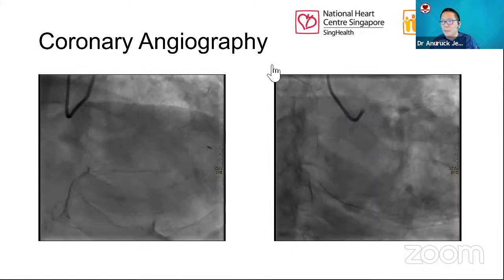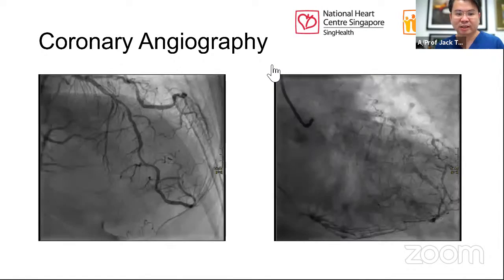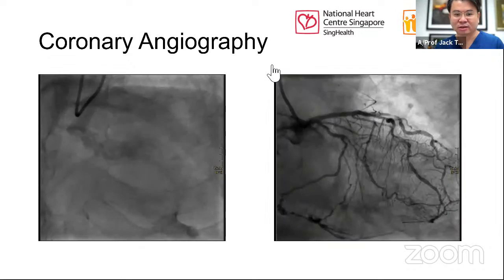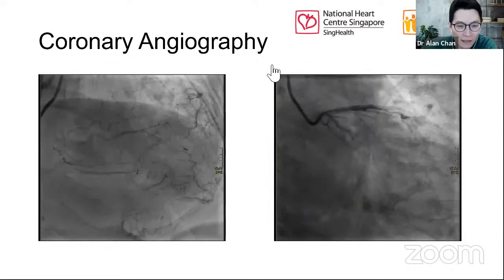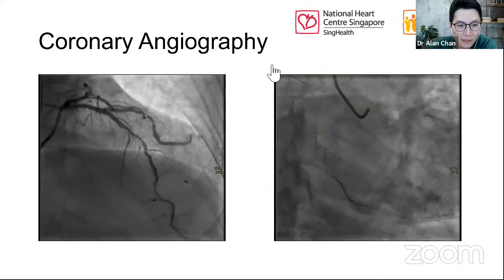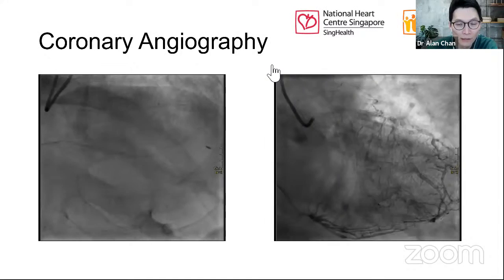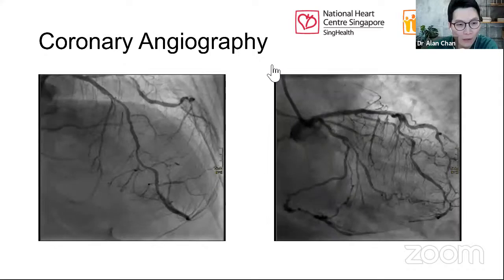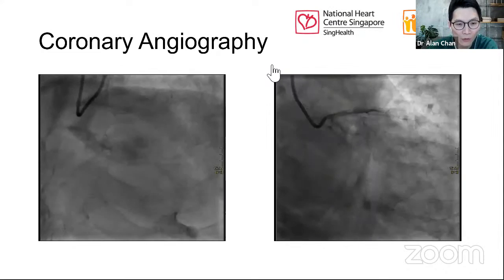what happens next. So can I ask Alan, would this be a lesion that you pre-dilate before you pass the OCT catheter, or you think this is okay? Can you give us some pointers? Yeah, I think from the angiogram, the OCT catheter is able to cross, but the issue is a very big LAD territory. So in order to get a good image, just taking a guide shot may not get a good image. So of course, we would really go ahead for the OCT image.